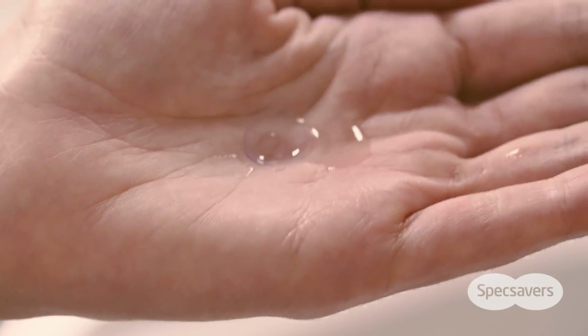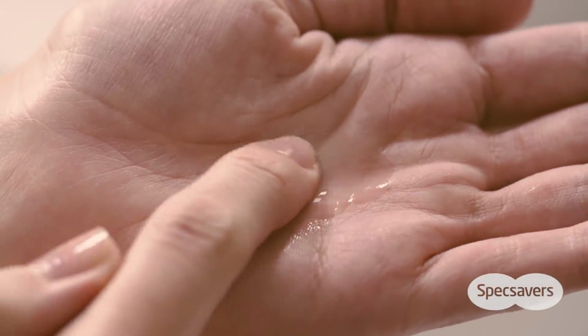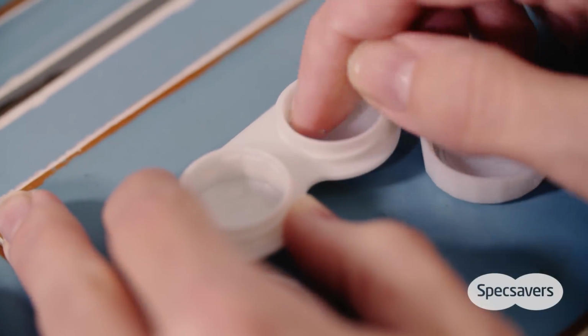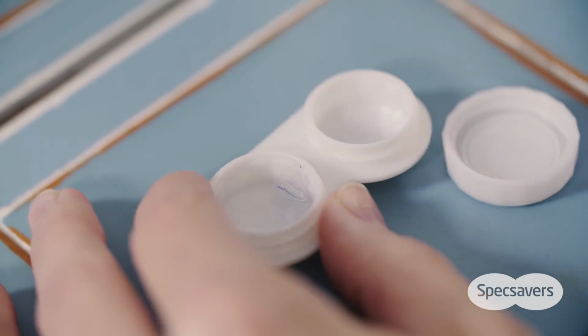To clean your lens, put a few drops of solution on it and rub gently from side to side for about 20 seconds. Once you've finished, put a few more drops of solution onto the lens to rinse it. Once you're happy that it's clean, you need to put it into your contact lens case for storage.